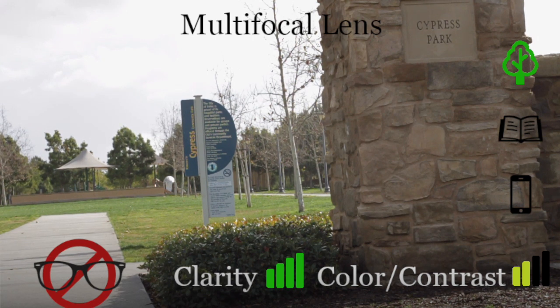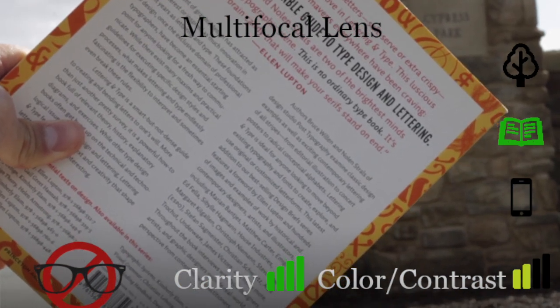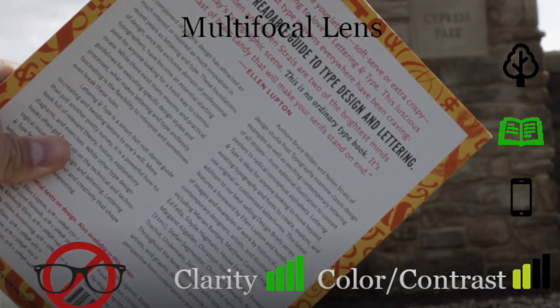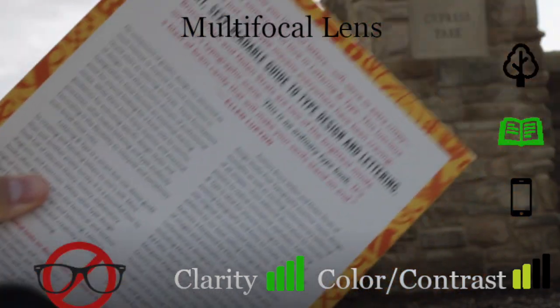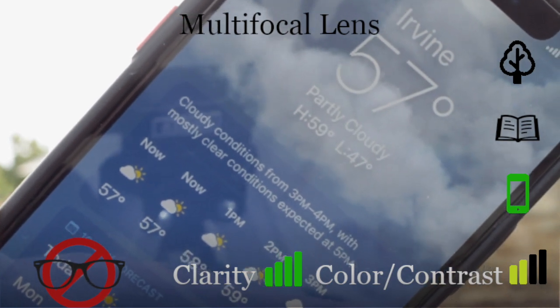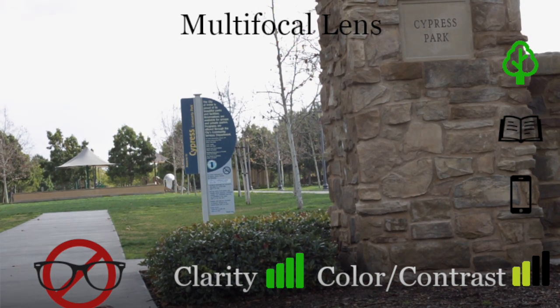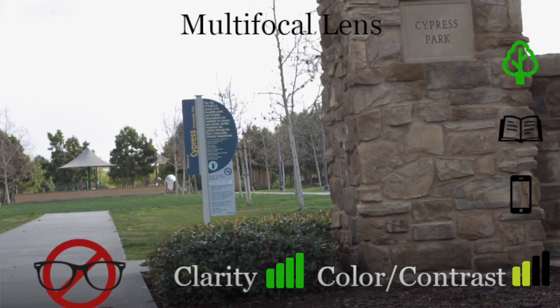Out in the distance, nice and clear without the glasses on. And next up, we'll hold up a book at about arm's distance here, and we'll be able to make out those words without glasses. That's the benefit of this lens. It lets you see at these distances without putting on glasses here. Next up, we'll hold up a phone closer to our face, and still we're going to be able to read those words on the phone clearly without glasses. Again, out in the distance, nice and clear, but you'll notice a little bit diminished colors and contrast here compared to the other options.